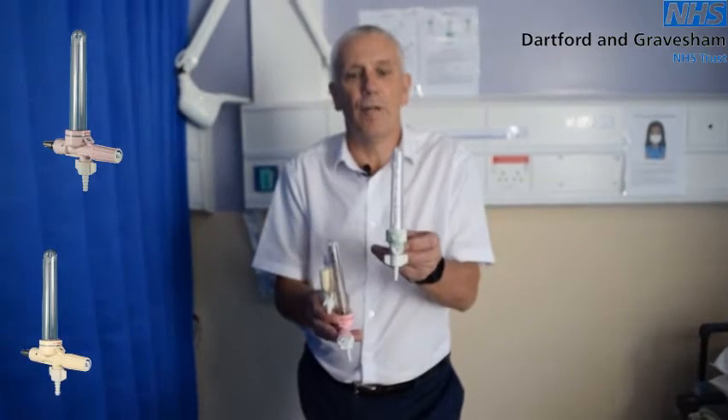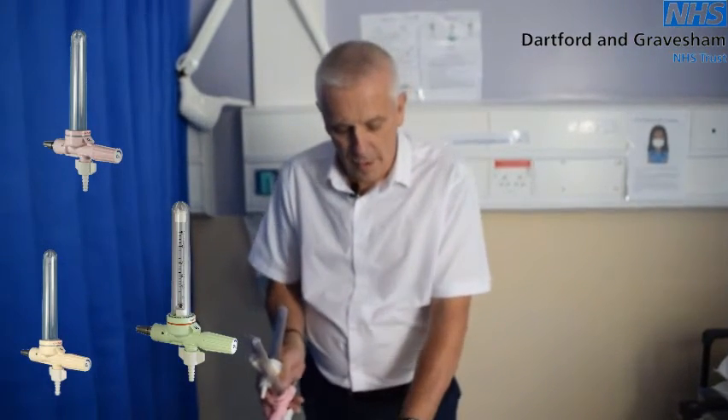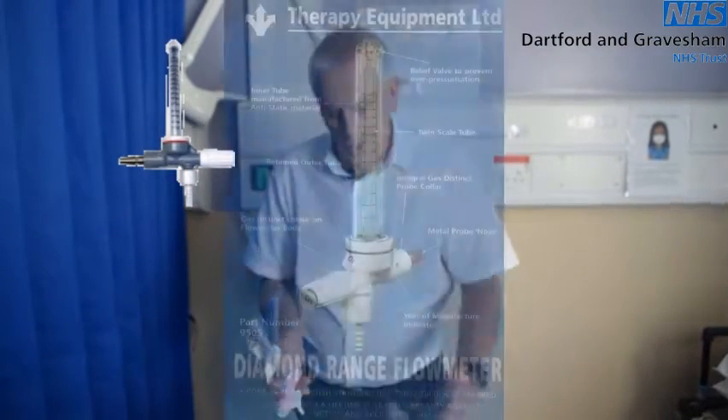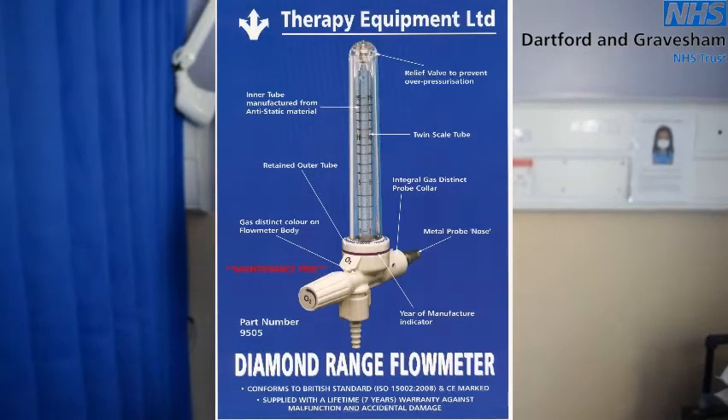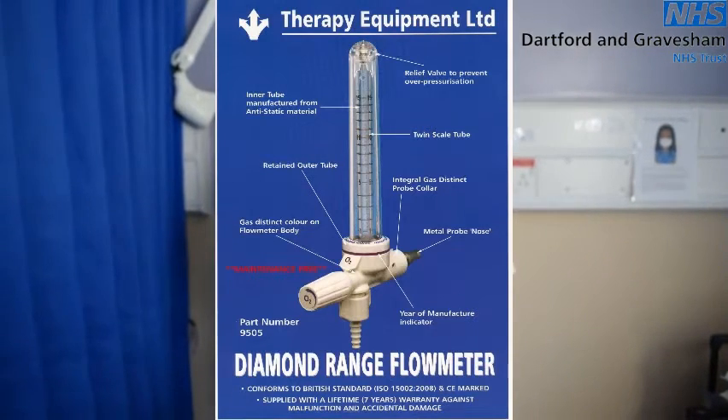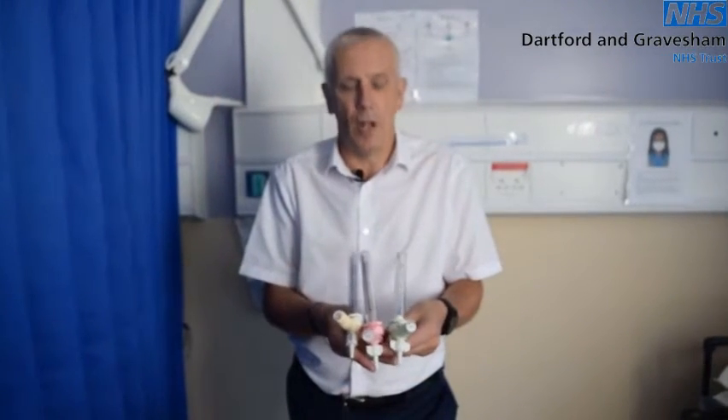We have a 0 to 5 litre flow meter, a 0 to 2 and a half litre flow meter, a half litre flow meter, and the last one is a high-level flow meter at 30 litres. You might find these anywhere in the hospital, so the main priority for you is to be aware of what flow meters are behind the beds.